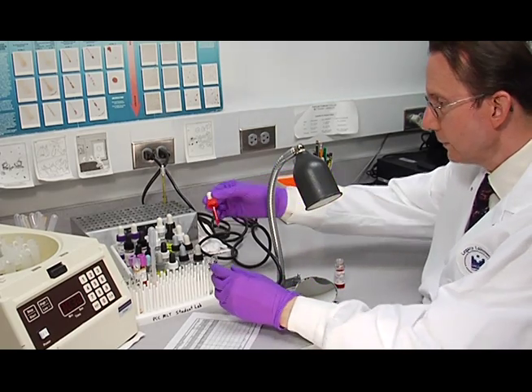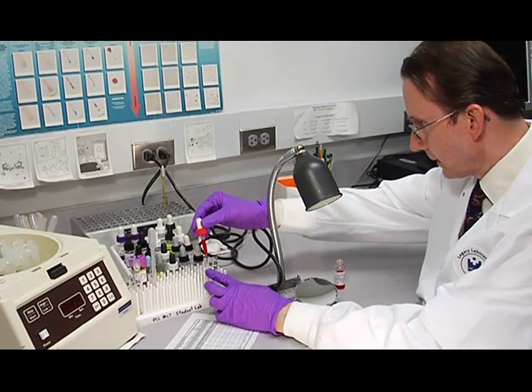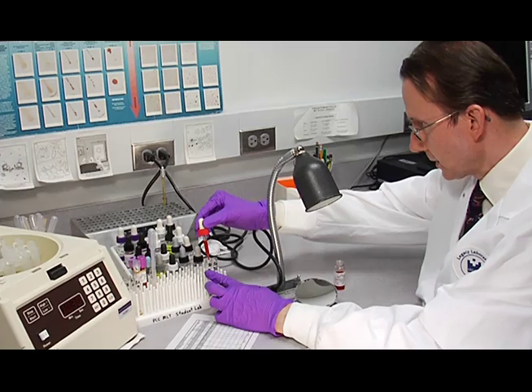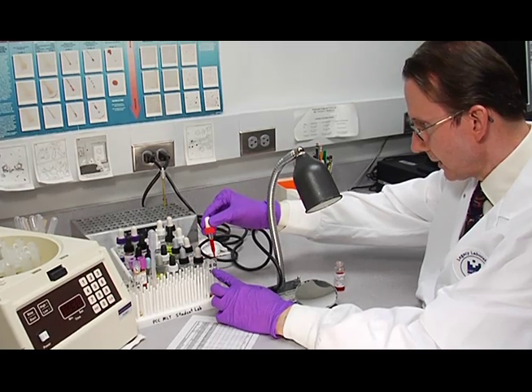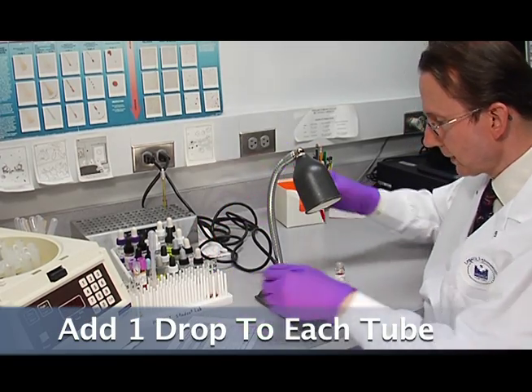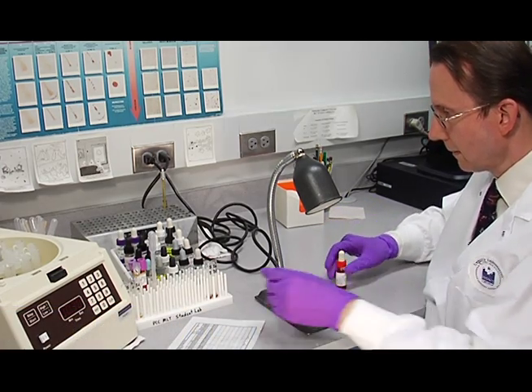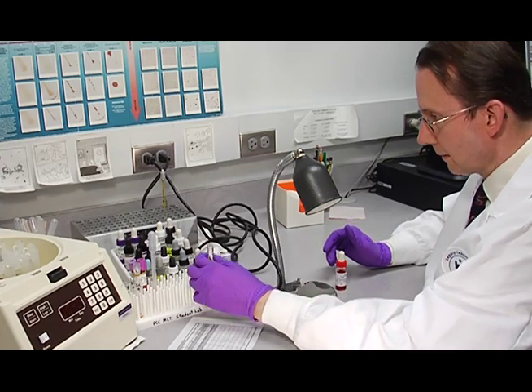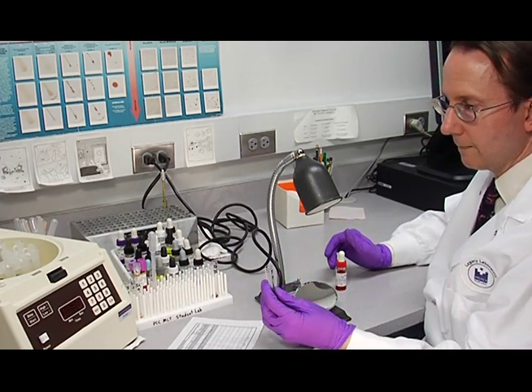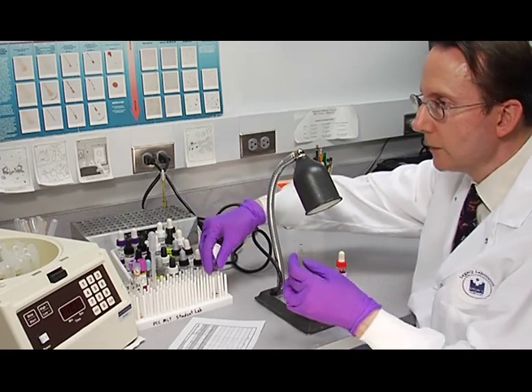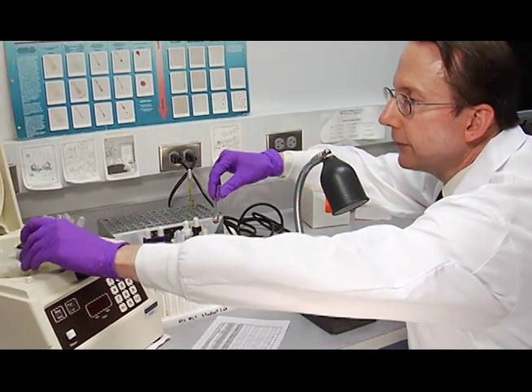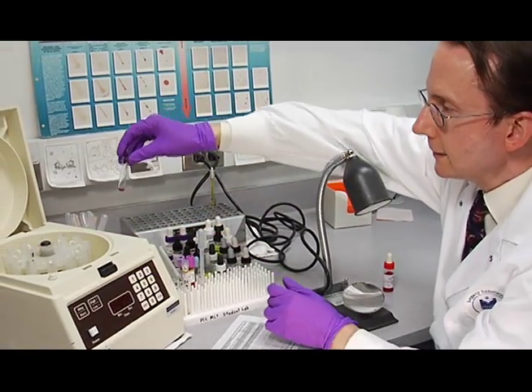So now I'll add one drop of the control cells, the check cells, to each of these tubes. And then we'll spin those down for 30 seconds in the centrifuge.